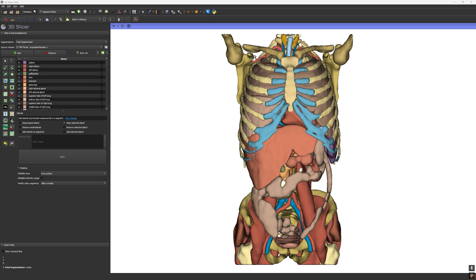So in this video I'm going to show you how to install TotalSegmentator — it's very simple — and how to use it step by step in 3D Slicer, and maybe we will discuss some real applications for surgery and medical research. So let's get started.